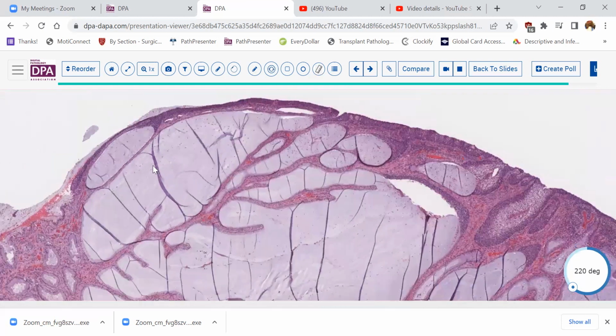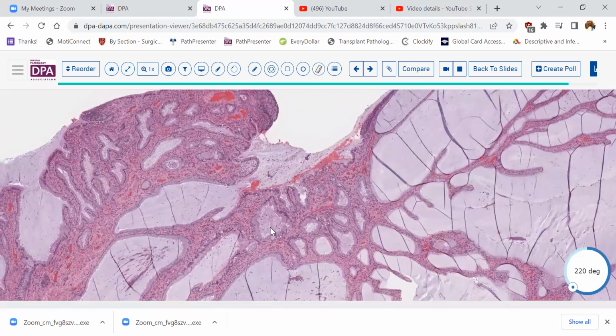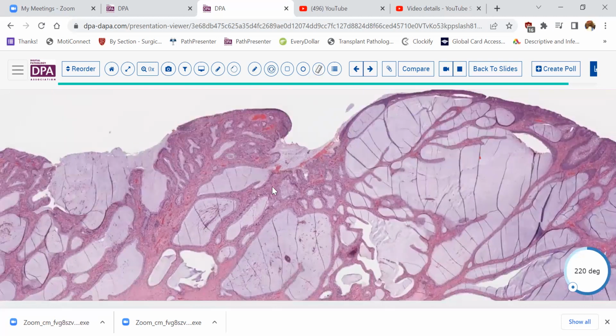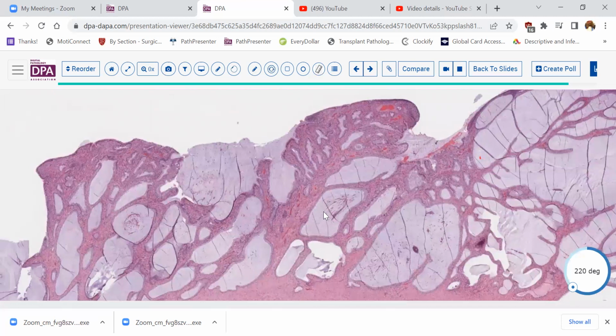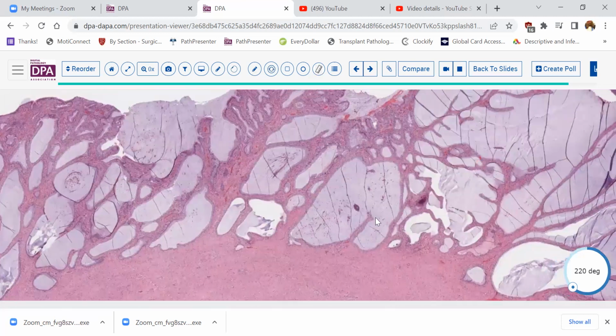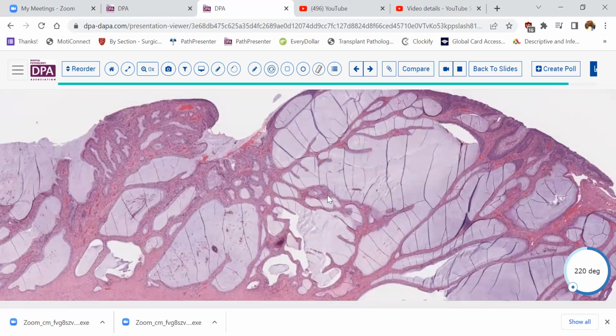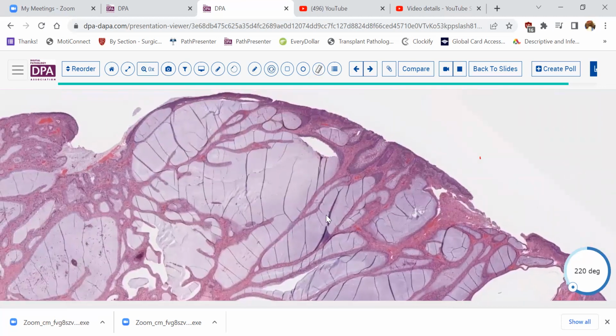But this patient was pregnant. And so following delivery of her baby, she opted for an immediate hysterectomy. And I believe that was because there was some pregnancy complication. If I recall correctly, she may have had a placenta accreta or something of that sort. So we don't often see the cervix in terms of the gestational response. And this, of course, is the physiologic hypersecretion of mucin to prepare the cervix and the birth canal for transit of that very large miracle that happens with the growth of a baby. So that was, I thought, a very interesting case for just awareness sake.